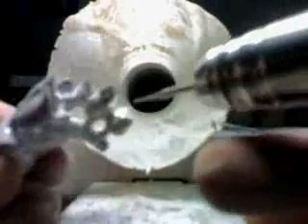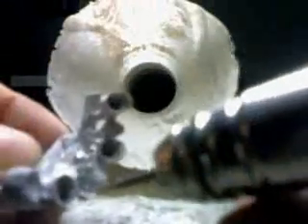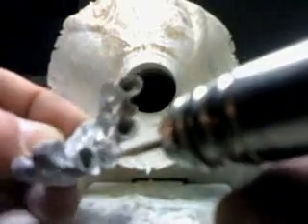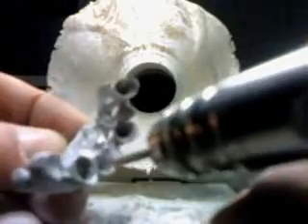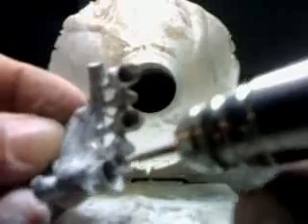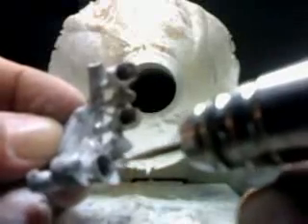As we can see, the five ingots of metal we used were just fine for this purpose and for this casting. From here we're going to move to our sandblaster and we'll be able to see the cleaning of this coping and of this framework.